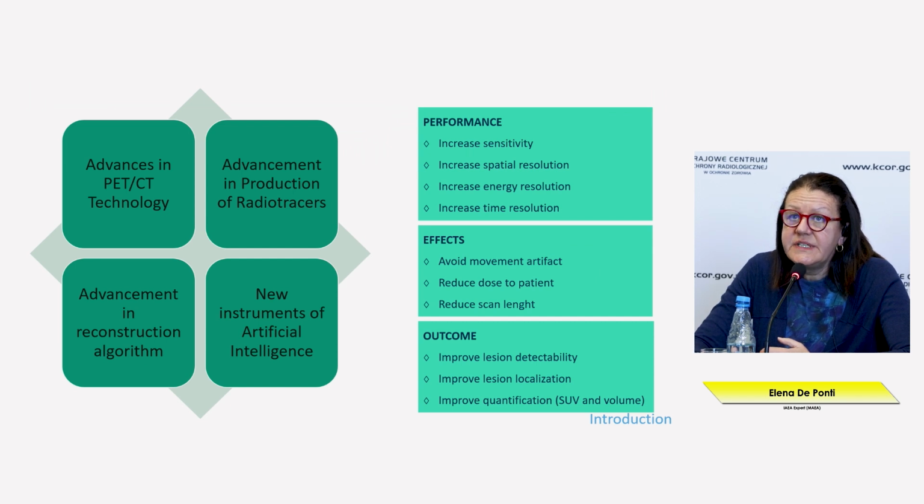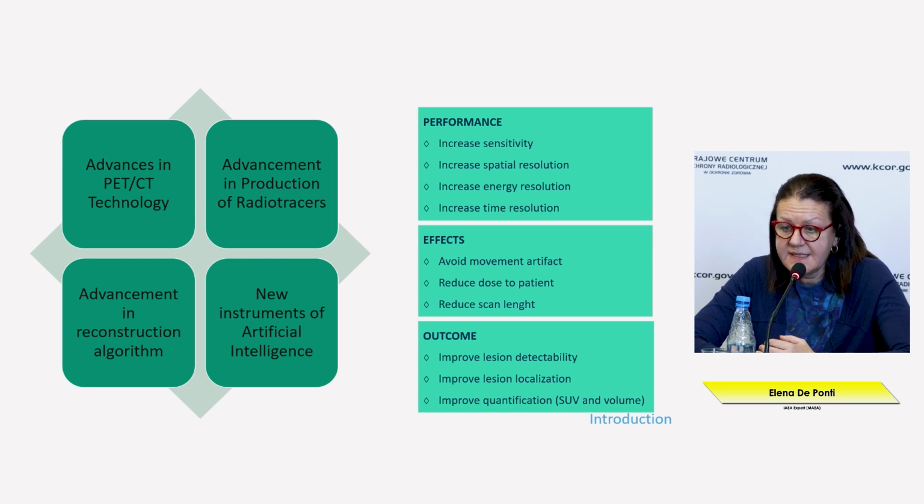So over the 30 years in which we have used the PET-CT technology, we have seen many advances in technology, but also in the kind of radio tracers that are available nowadays. And we have seen many advancements in reconstruction algorithms that have improved the results, and now we are facing the new instruments of artificial intelligence that are coming into this methodology as well.